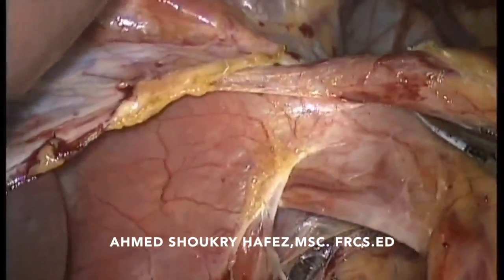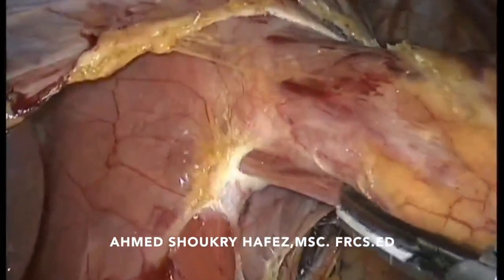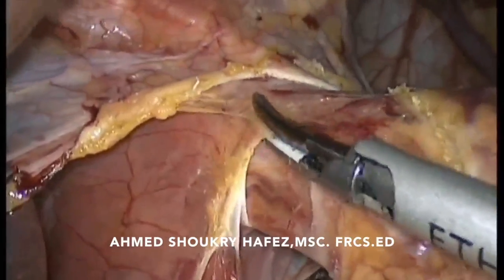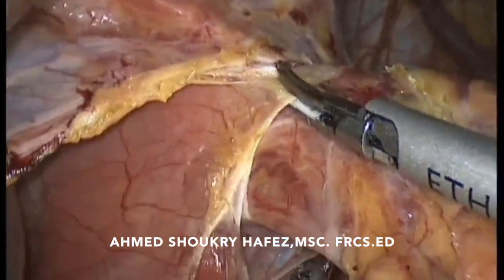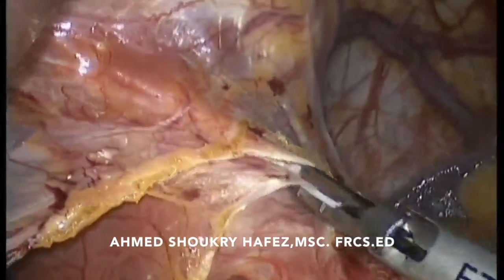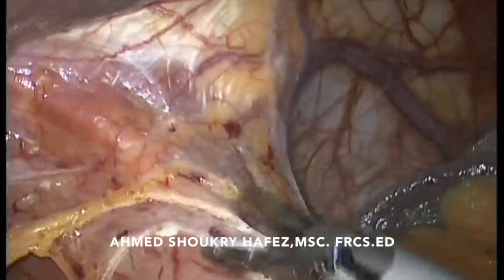Again, the posterior vagus is now evident and we must preserve it at all times. We continue dissecting the phrenoesophageal membrane carefully, not to injure the vagus or the muscles of the crura.